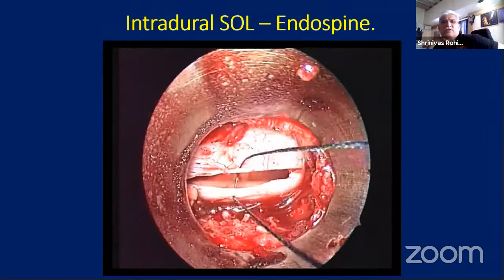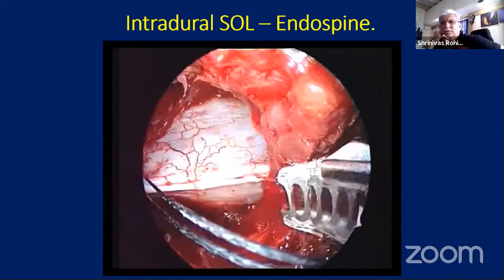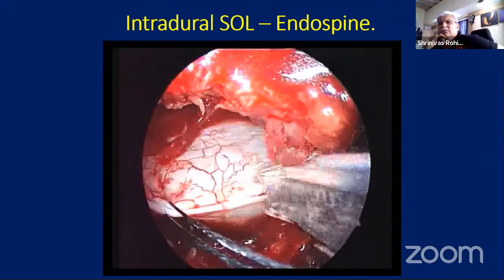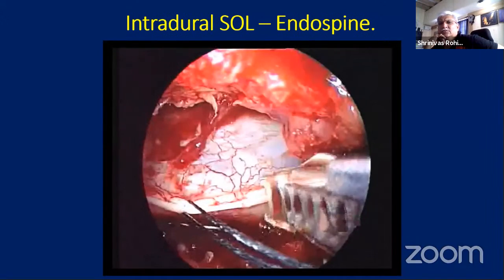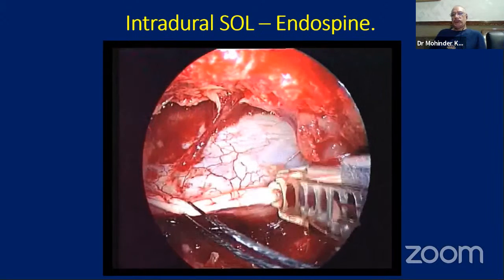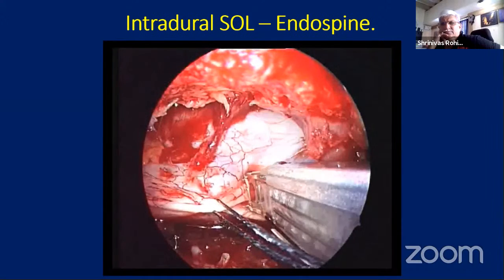So the Destandau is a versatile technique. You can use it for each and every pathology, except the intramedullary tumor. This is watertight closure with anastoclips. Easy and fast.